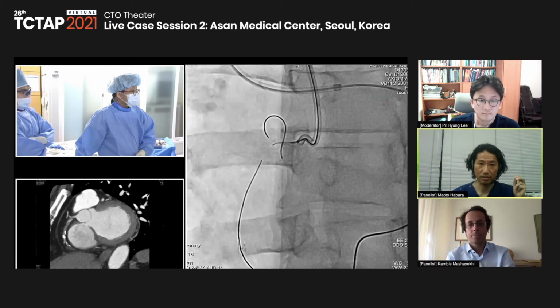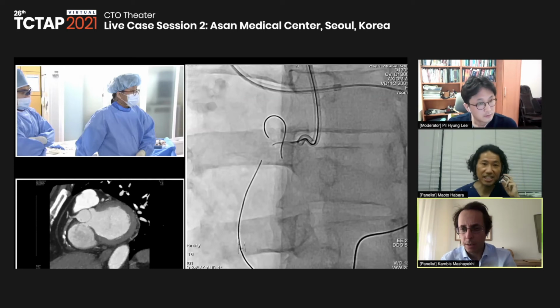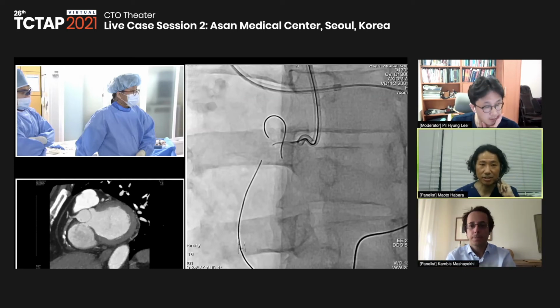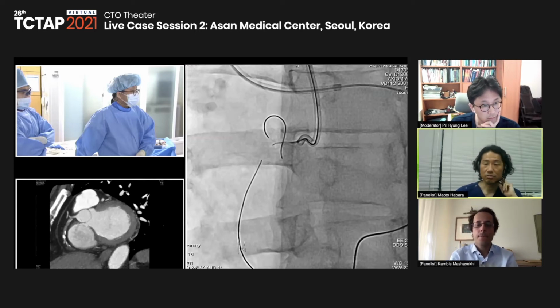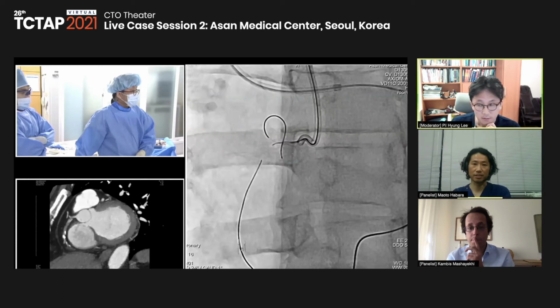resolves such a problem. In Japan, recently, we have a Jizai. That is a new microcatheter that is developed from the Fine Cross. Yeah, so that is something we sometimes use recently. The name is Jizai? Jizai, yeah, that is by the Terumo company. Okay. Yeah, sometimes this situation it is very useful. Yeah, thank you. Soft microcatheter. Thank you for the comment.